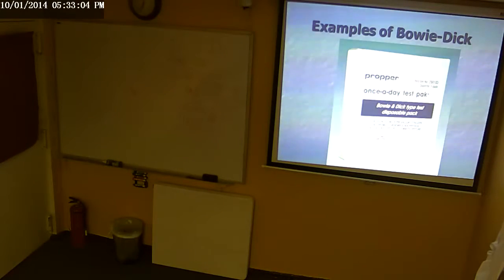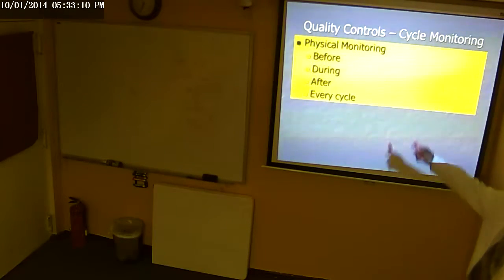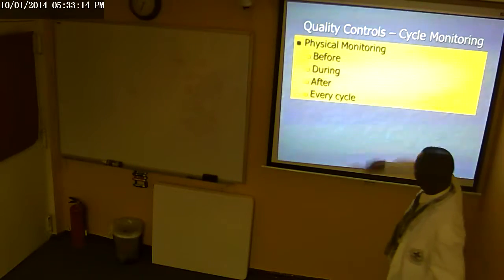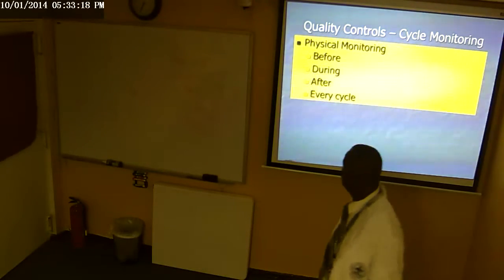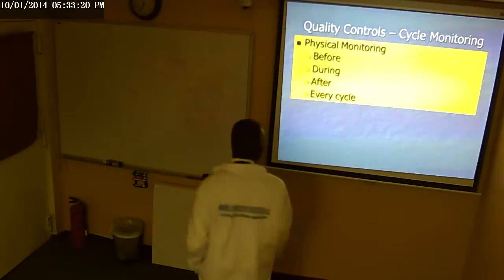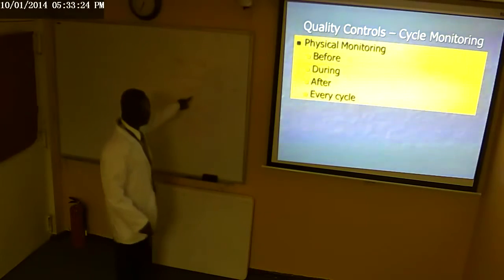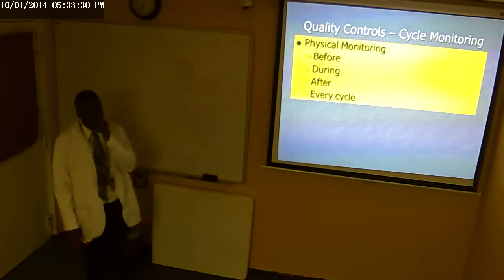Okay, so now let me look at the next one. I've already explained this. What is another name for the physical monitoring? The physical monitoring is the same as the... no, this one. What is this one? MI. Yeah, mechanical monitoring. That's the physical monitoring.